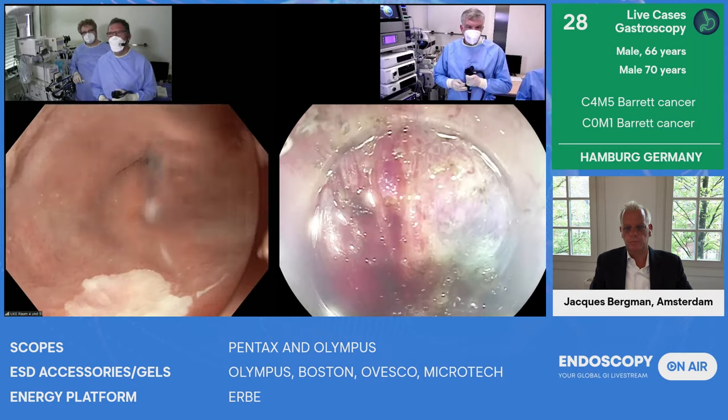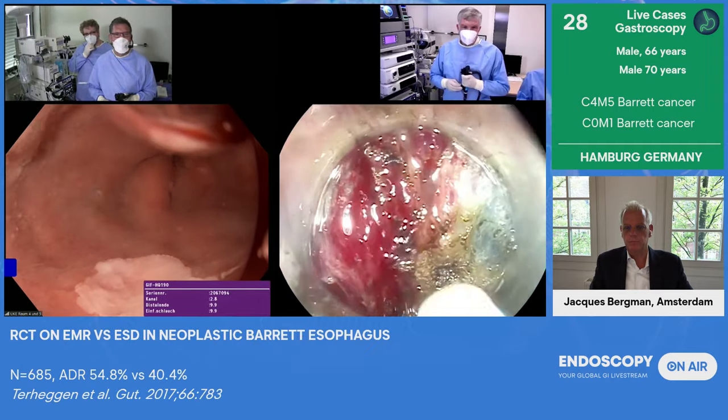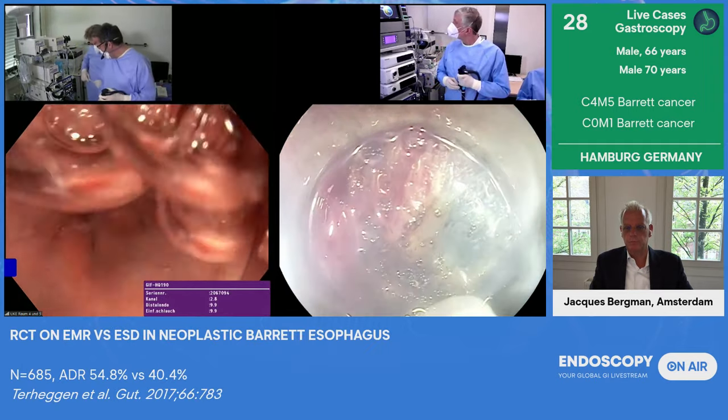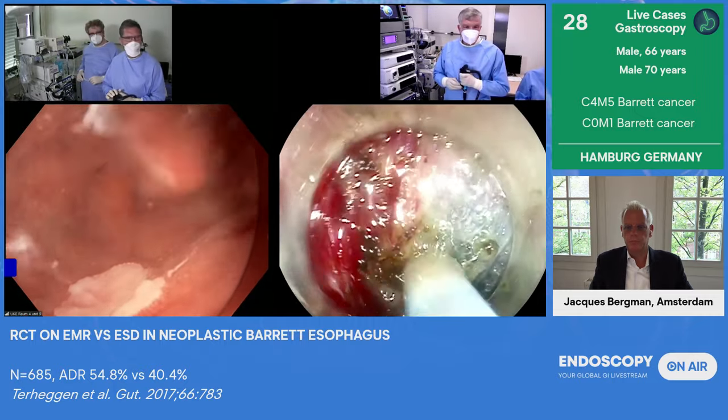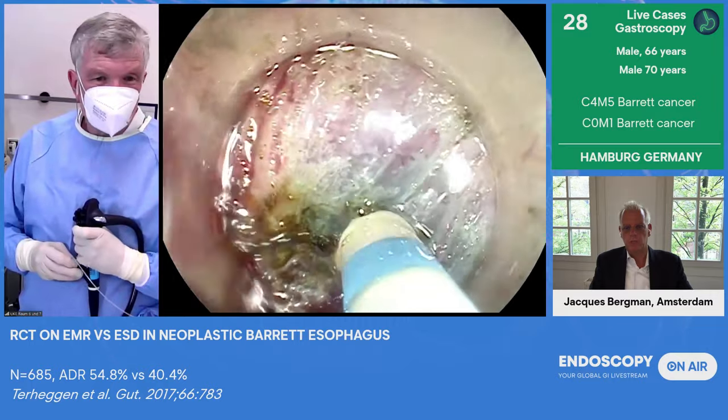So we will go on with a special current from Erbe. They programmed it for me. It's called twin coag and has a very nice coagulation function. So I get into the layer where I want.